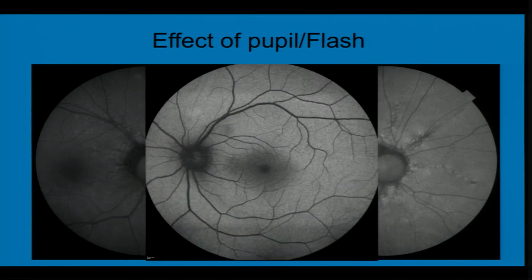And this is on ICG, this is a CSLO based image. You can see the picture is much brighter and the contrast is much higher. So you cannot compare the images taken on one machine platform with another platform. So CSLO images and the autofluorescent images taken on traditional fundus cameras cannot be compared.